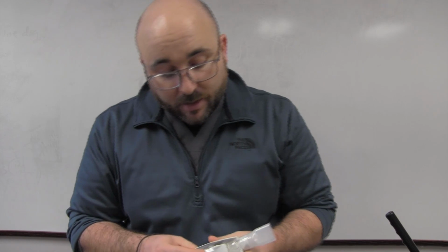So some keys to taking it: 5 good breaths is good, and a directed cough. So I'm going to do 2 breaths and show you how to do a directed cough. Big breath in, seal your cheeks, blow out, but when you feel like you're out, keep squeezing that last bit. That last bit of air really seems to be what knocks stuff loose. Our goal is not to knock it loose so that it just evaporates. No, we're trying to knock it loose to get it into large airways so we cough it out.